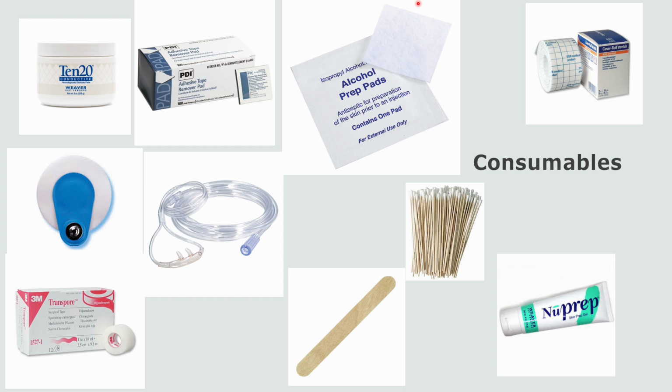NuPrep gel, right here, is an abrasive gel. Abrasive means it scrubs off. It cleans the skin and prepares it for an electrode. Remember that if you rub hard enough, you can break the skin and make a patient bleed. You also don't want to scrub so hard that it leaves a red mark.